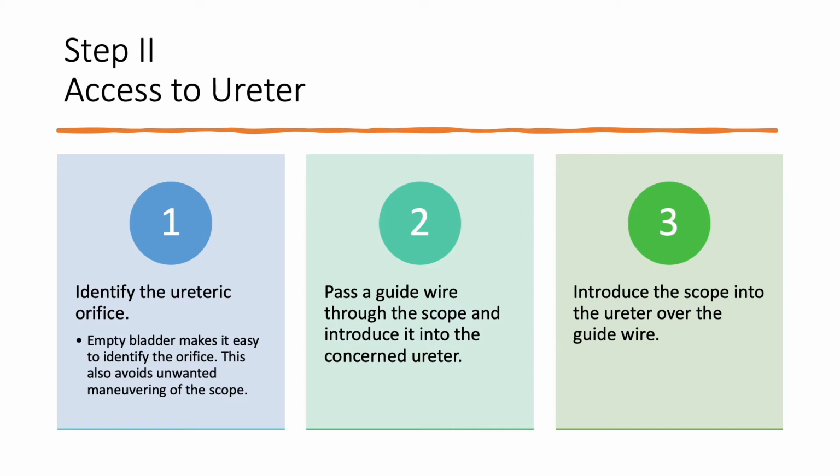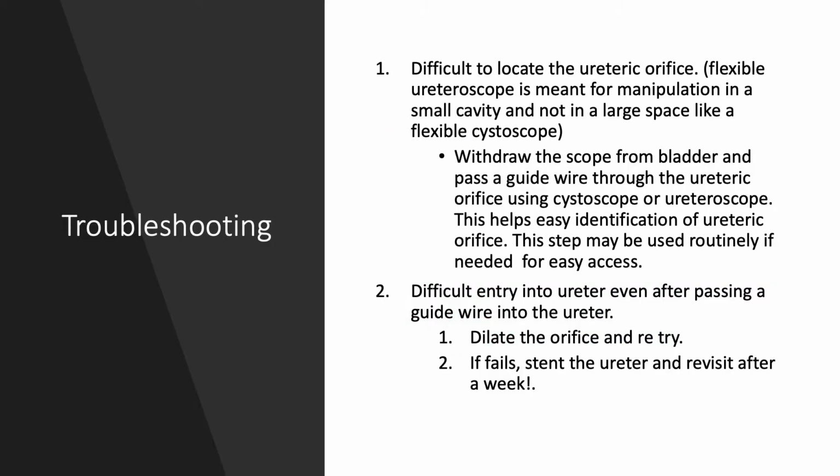Though these steps look simple, many times we need to keep on maneuvering the scope in an attempt to locate the orifice and manage the guide wires. So let us look at the alternatives and the troubleshoots for this technique. Why do we have difficulty in identifying the ureteric orifice?